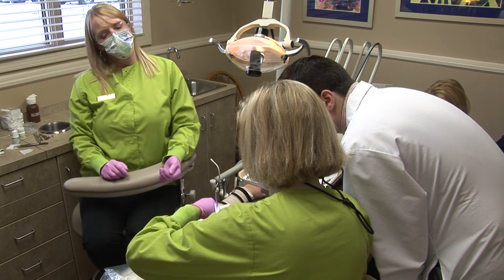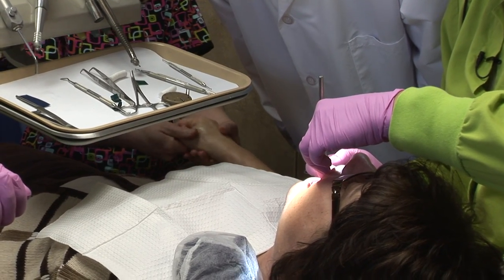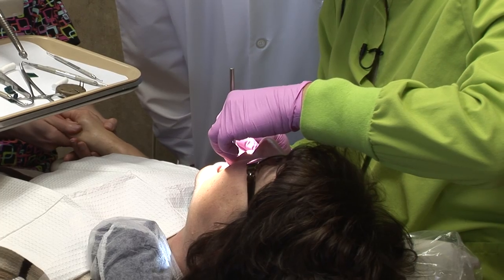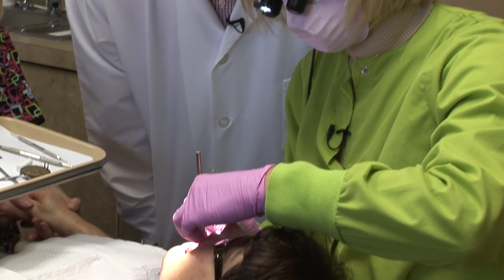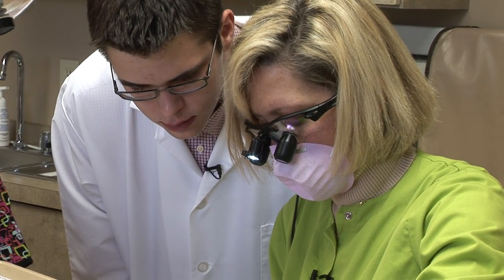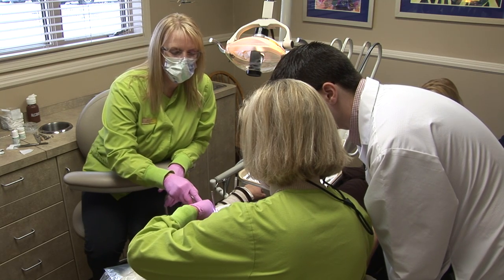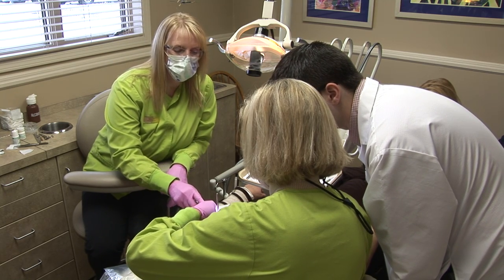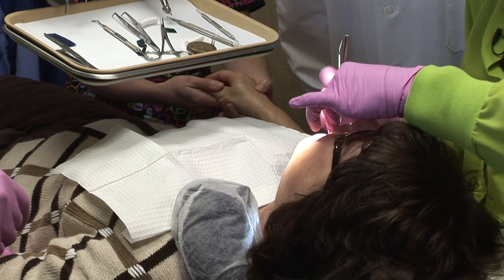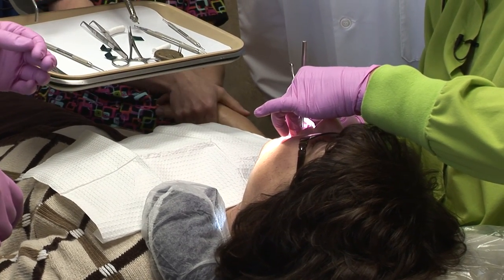So the tissue around it turns kind of light in color — can you see that? See how it's turned kind of light compared to that? It looks almost white. That means it's working. It works relatively quickly. And if there's any blood — there's a little bit right there — the hemostatic agent makes it turn kind of brown. It basically clots the little tiny capillaries that are seeping in that area. Sometimes the fillings go way under the gum line depending on how deep the cavity was or the crack, and so you get a little bit of bleeding.